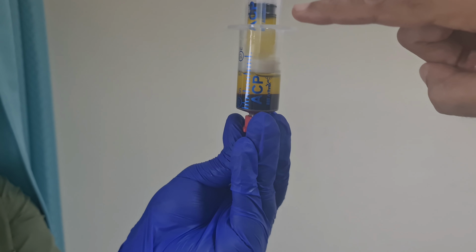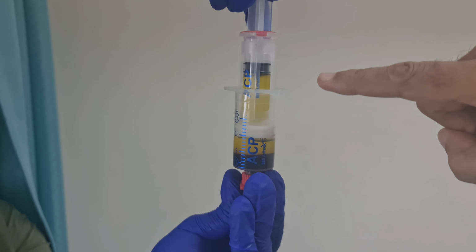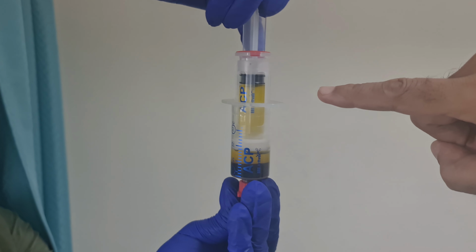You can see that it is rising. And we will get 6 to 7 ml of PRP.